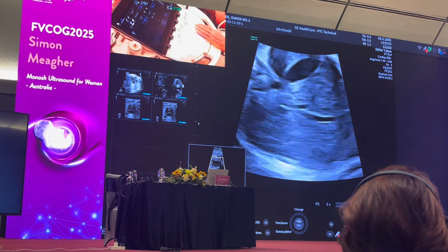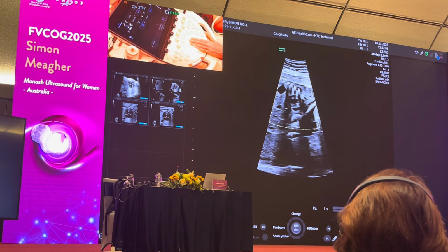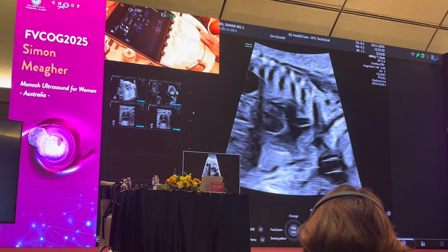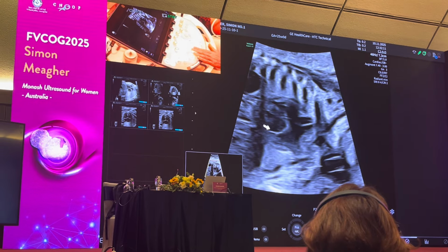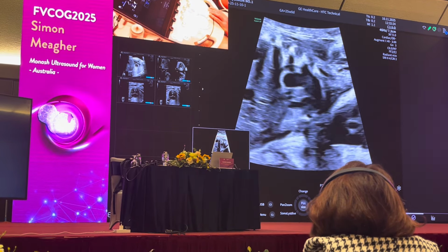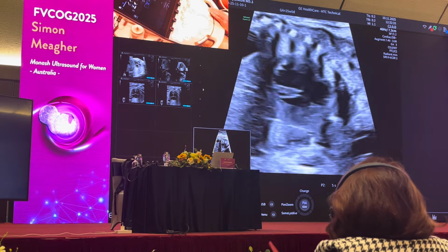Okay, bring it to the next stage, I think. She's there. So now I've got the short axis. We come across, you see the left and right ventricle, and then we come up to the level of the AV valve, and now you can see it. This is the point where the valve opens, with the common AV valve. So this tells me for sure that I'm not looking at a partial AV valve defect, I'm looking at a complete one. So I come up on the short axis and slowly come to the point where you see the valve, and there's the common AV valve.